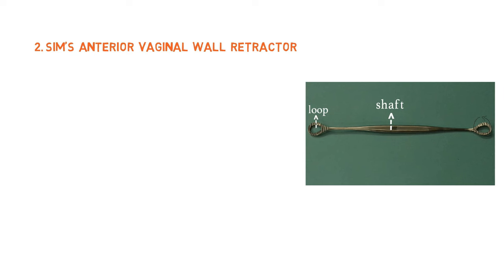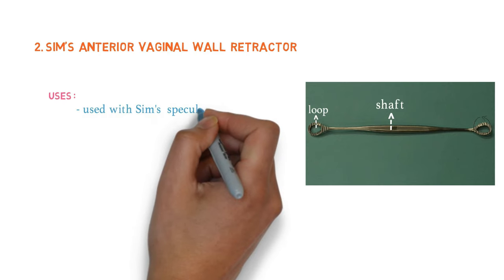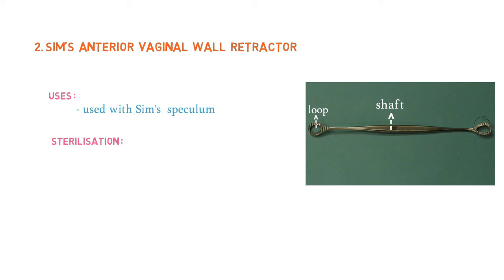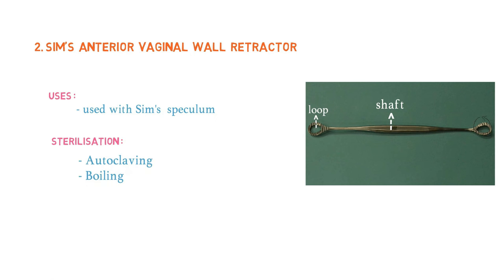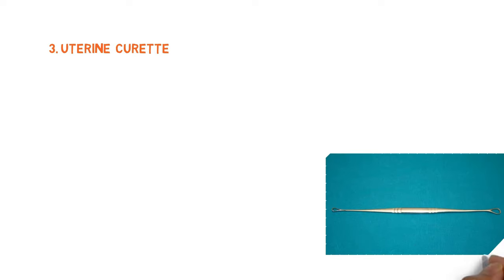The uses: as mentioned with the previous instrument, it is used together with the Sims speculum. The sterilization method used is autoclaving and boiling, just like the Sims speculum. Our next instrument is the uterine curette. Here we have the sharp end, the serrated handle, and on the opposite side we have the blunt end.